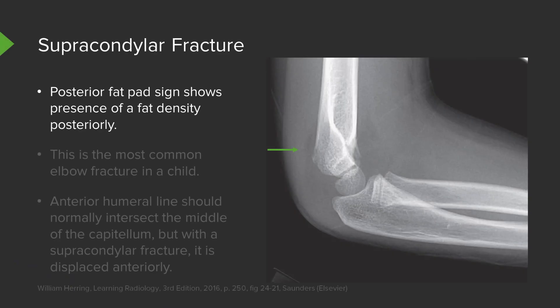Here we have a supracondylar fracture. In adults, a posterior fat pad sign — the presence of a fat pad posterior to the distal humerus — would suggest a radial head fracture, which is very commonly seen in adults. In kids, however, the most common elbow fracture is a supracondylar fracture. So when you see a fat density posteriorly, as indicated by this arrow, that would indicate a supracondylar fracture, which can otherwise be very difficult to see. This is the most common elbow fracture in a child.